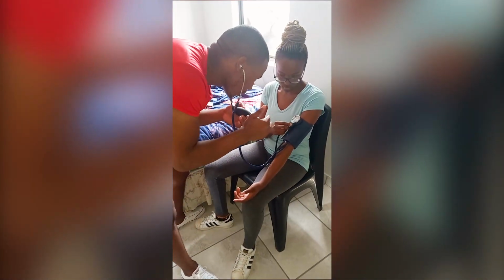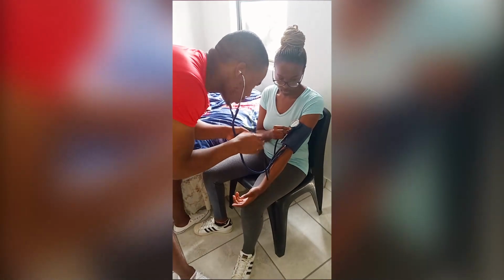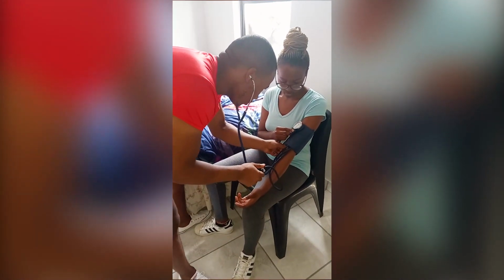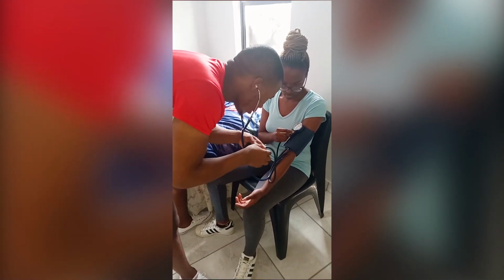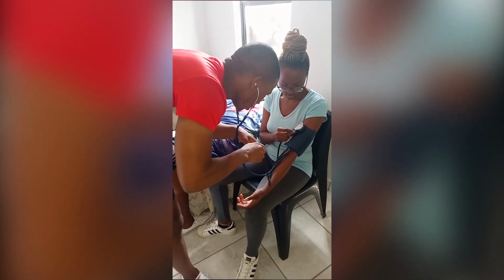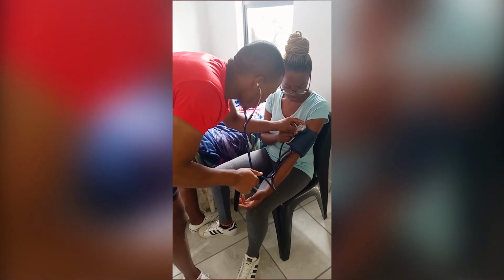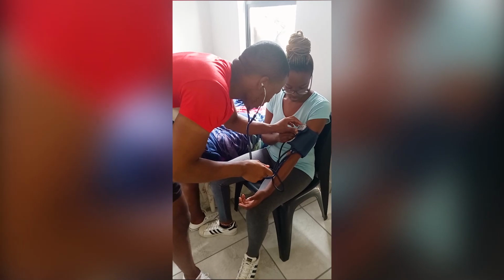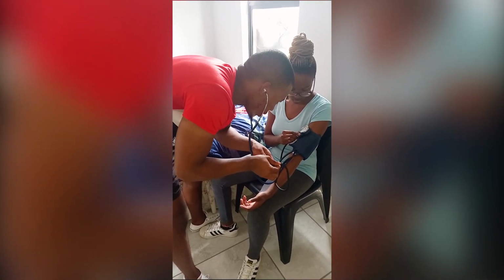Now we will check for the high and the low side sound. As I said, we managed to calculate your blood pressure. Let's go. Let's close. Pump to 200 and then slowly release the valve to allow the air to escape.